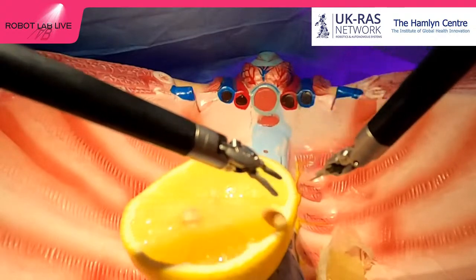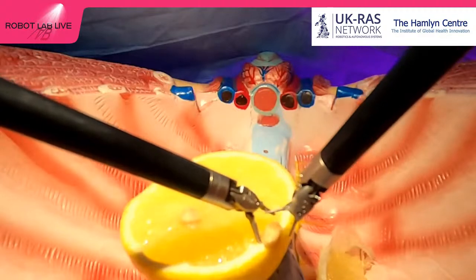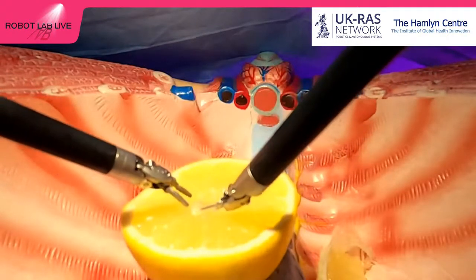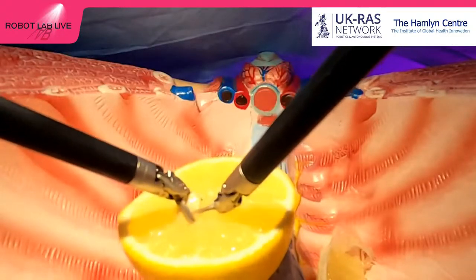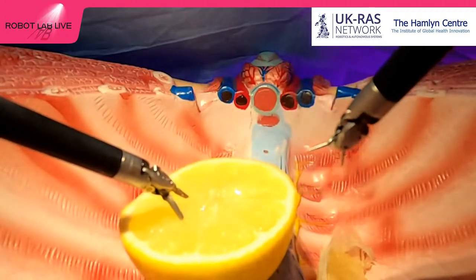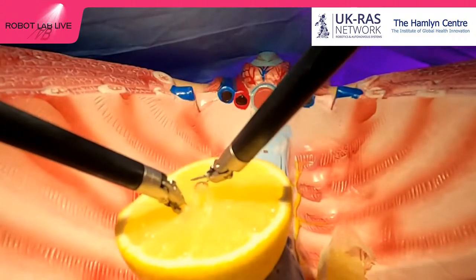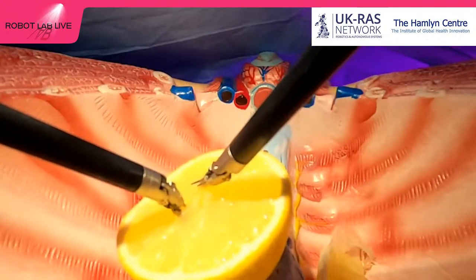So Ziyan, who is one of the friends that is helping us today, is working on solving this problem. And if you want to have a small idea of how this would work, you can think of a video game where you can only go to certain sections of the map, right? So it's kind of like having a safe area in which the robot can operate and some no-go areas around it.